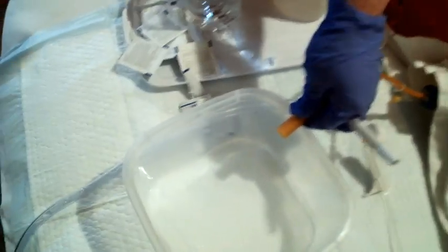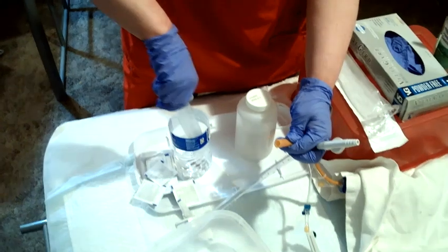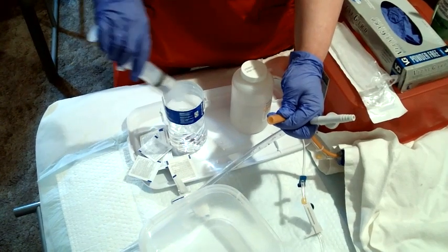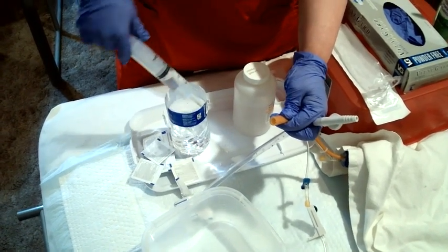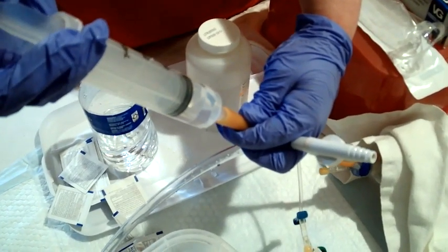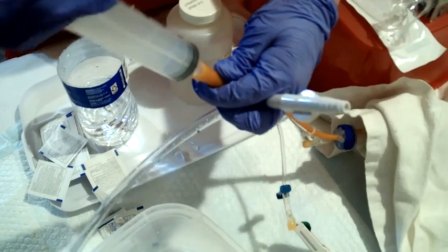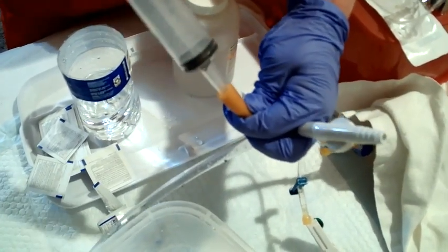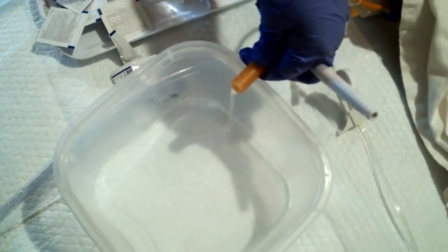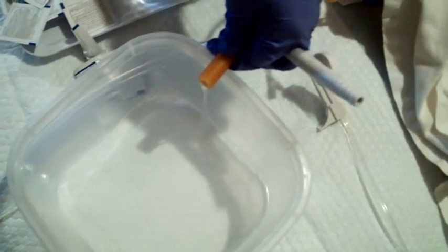Right now, normally it would be draining. If it's not, you're going to do it again. Make sure you do not touch the tip of the catheter to anything around you. If you do, you need to stop and clean it. So again, I'm going to do 30 cc's. Connecting and pushing just a little bit faster. Again, more pain, more uncomfortable — the patient might be screaming at you. But most of the time — look at that — it's coming out this time and it's draining.